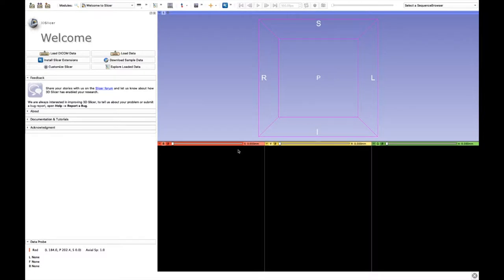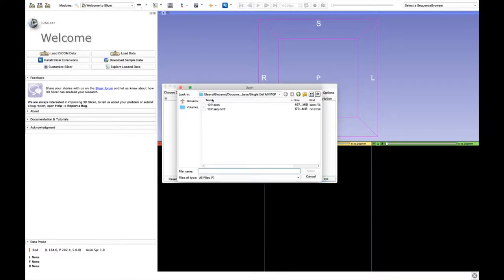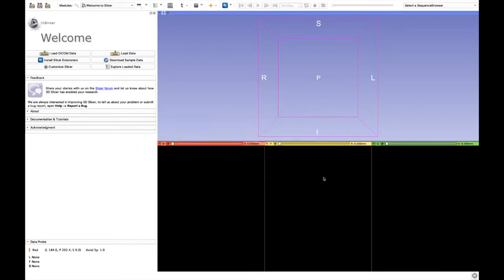The first thing to do is to upload a DICOM file. It is important to remember that the file should be a Cartesian DICOM with the extension .nrrd.